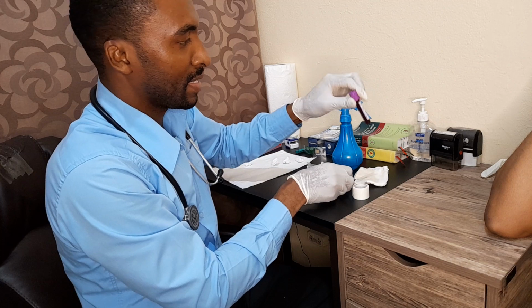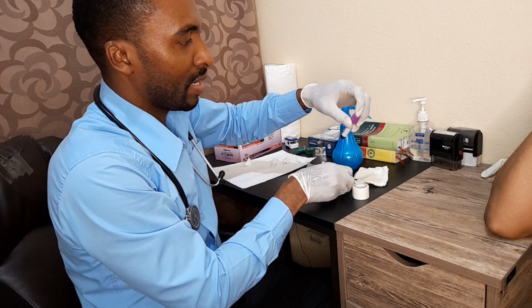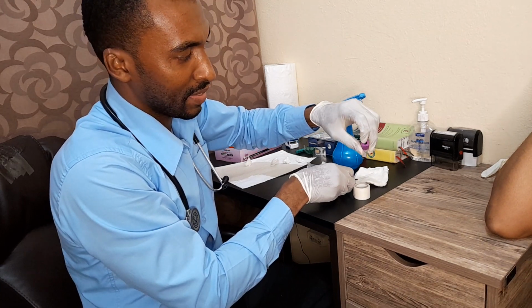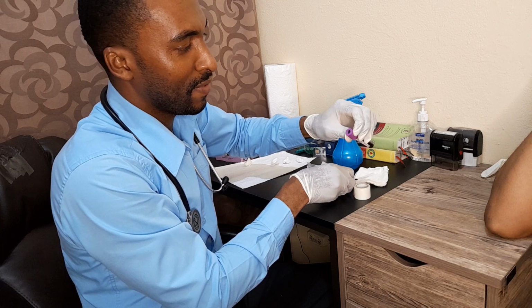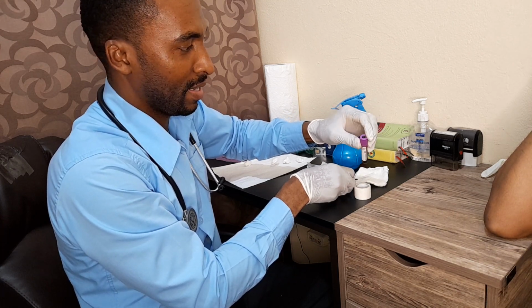And then I would insert the needle in the top of the test tube. As you can see, it is designed so we can just insert the needle at the top. But at the same time, you have to be very careful not to be nervous so you don't shake and have a needle stick injury.